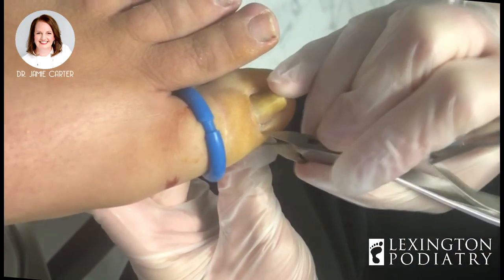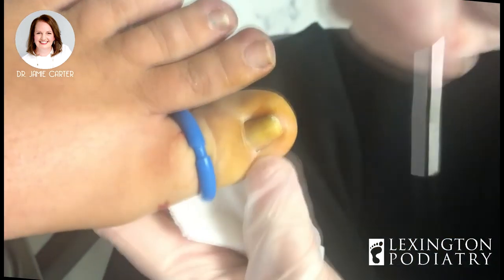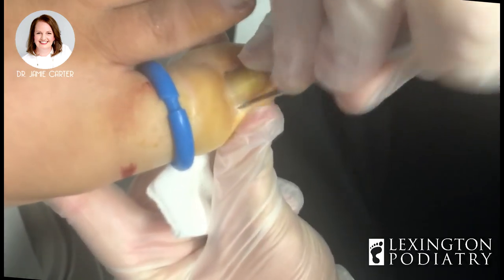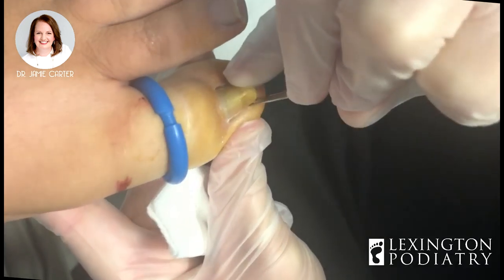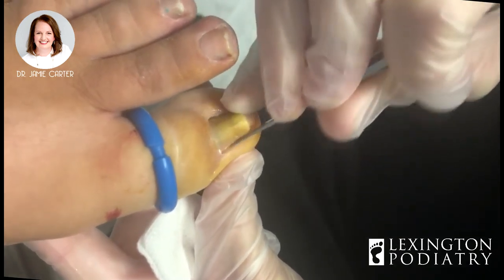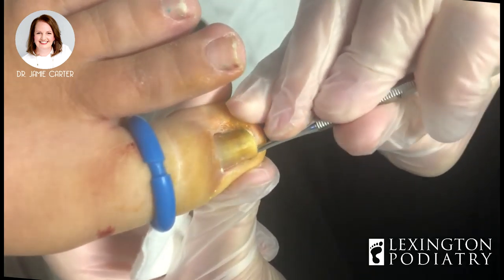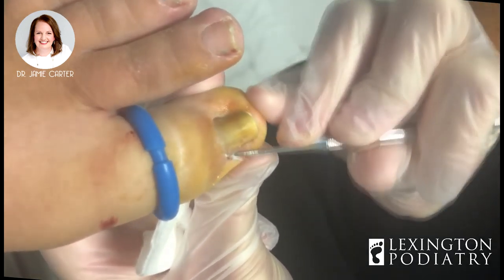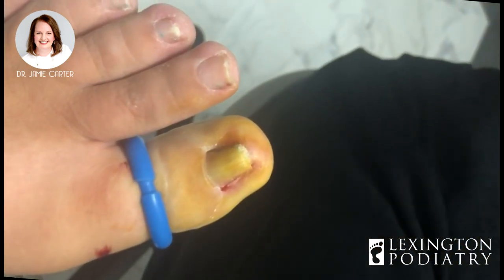Can you feel this? Okay. You may feel some pressure, some pulling — if it's anything other than that, let me know. We're gonna loosen the skin all the way around the edge of the nail. She said not to mind her green toenail polish that wouldn't all come off. When I loosen it from underneath it's really really firm because the nail is so thick.